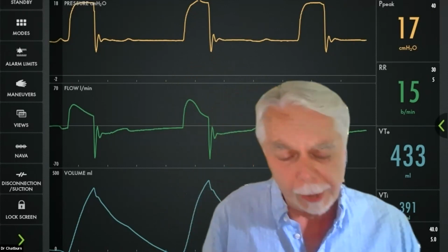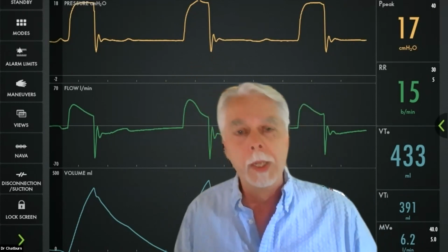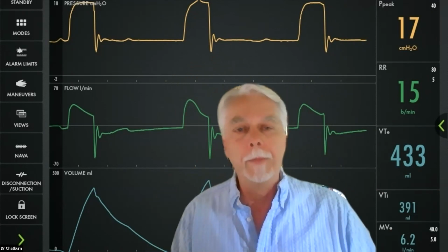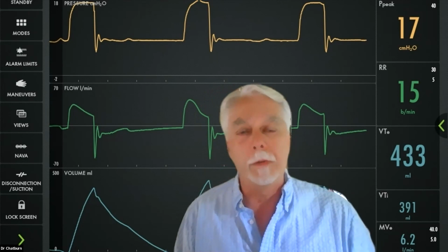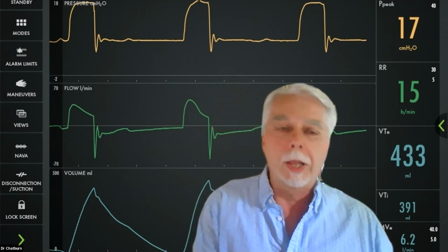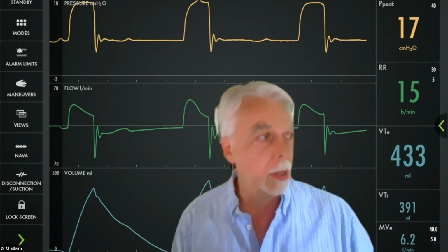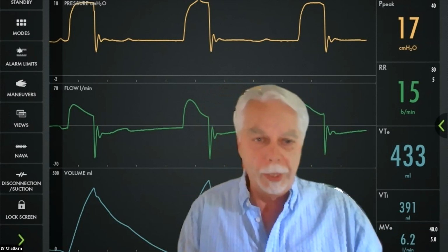But aside from that, the paper that I mentioned earlier on the rational framework for selecting modes lists a whole bunch of modes, not all of them that are available, but it lists their technical capabilities that make them more or less robust in terms of serving the three goals of ventilation, which again are safety, comfort, and liberation. So simple modes at the bottom of the list, volume control, CMV, or volume assist control, like everybody likes to call it, only offer one thing, and that's safety. And that's preset minute ventilation.